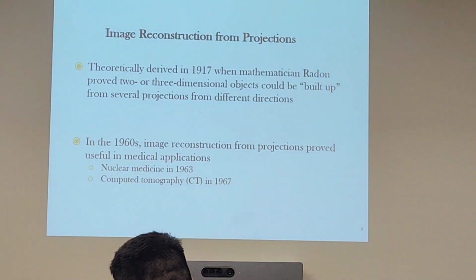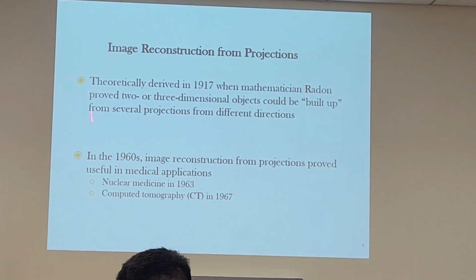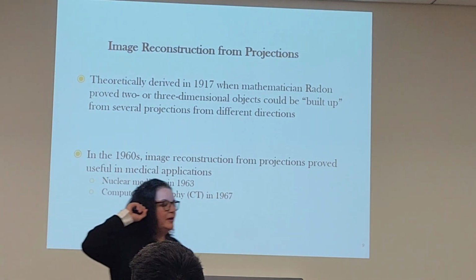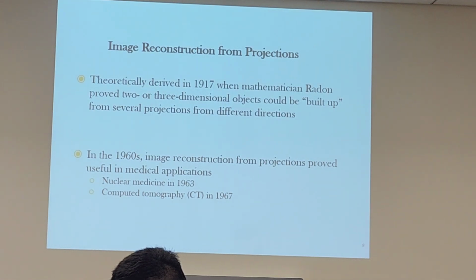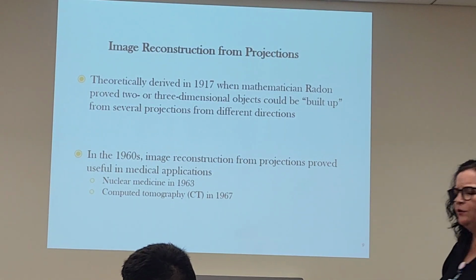All right. So it's going to go back into the applications of image reconstruction. So even image reconstruction, taking what kind of image into another kind of image. Where does it start off? What data acquisition? What types of positioning are we getting? What type of views are we getting? What'd you say? Axial. We're only acquiring axial images. We're only slicing the bread. Make sense? And we're constructing into what, Samantha? What can we reconstruct into if we wanted to? Phone a friend.